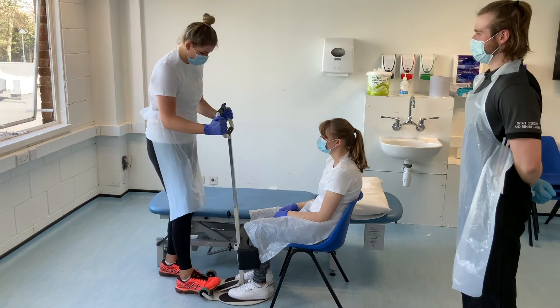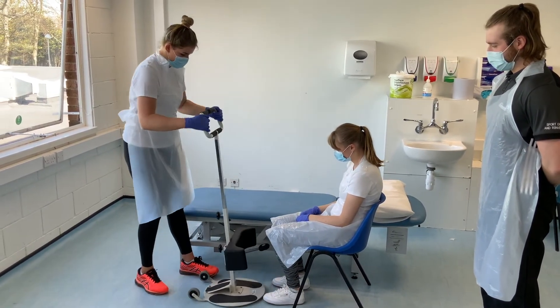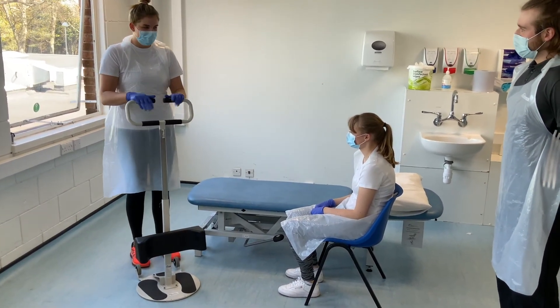Do you feel alright? Yes. I'm just going to shuffle this up to your feet and back them up slowly. Let's move this up, and I need to wipe this down so I don't spread any germs.